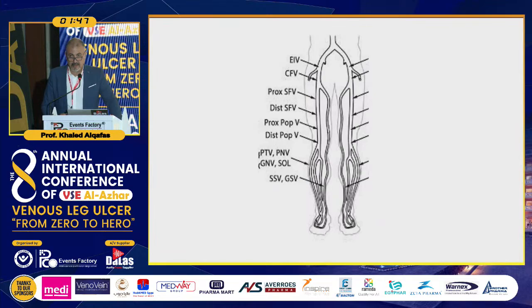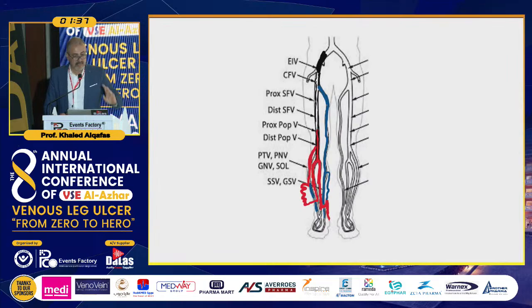Finally, if we are doing an ultrasound examination of the veins, our data must be depicted on a venous map regarding the occlusion, as you can see, iliac, or the refluxing flow you see in popliteal, infrapopliteal, and or the normal flow in the great saphenous vein.